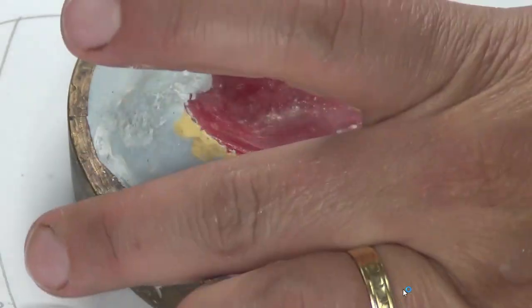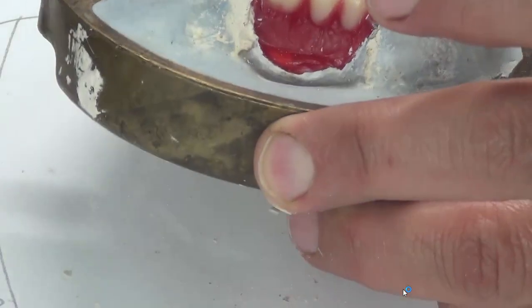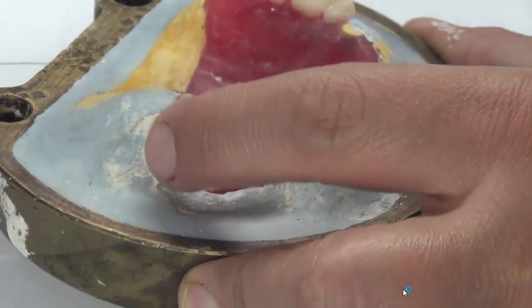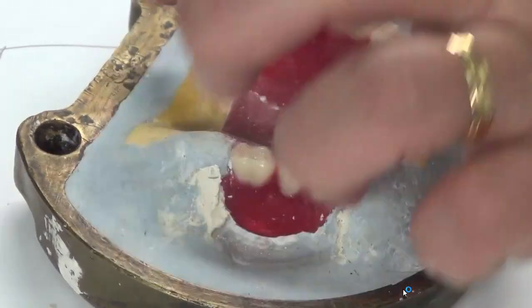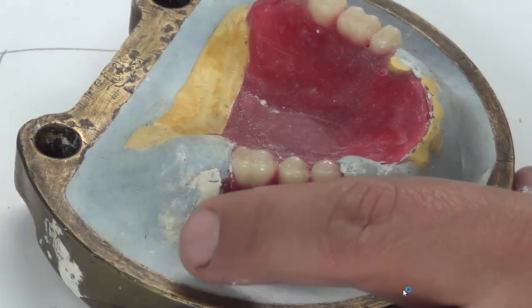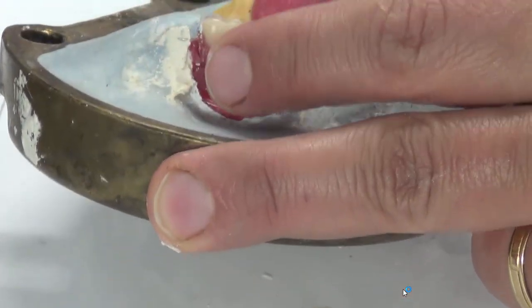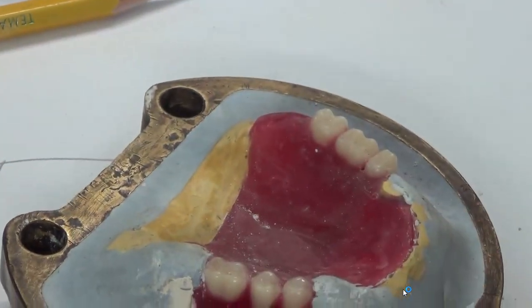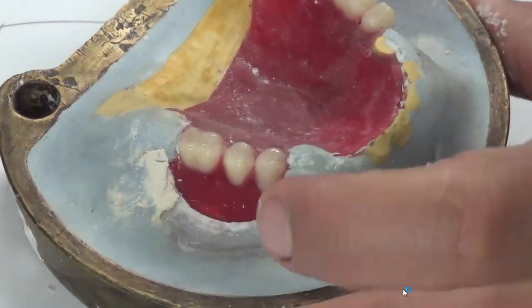Okay? We have exposed the wax fully. So if you look here, we have no undercuts. We have smooth, continuous surface between all bits and parts. And the wax is exposed to its full extent. So this is where, in the bounded area, you need to work a bit to expose the wax and clean all the wax. So the wax is totally clean.